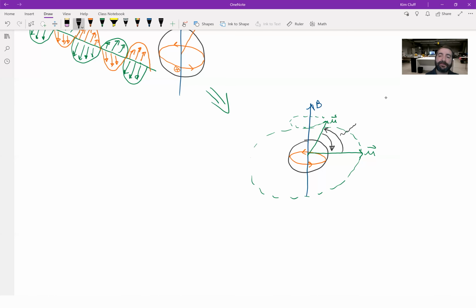And as it does that, it'll give off a radio wave, an RF frequency. So when it tips it down, this is when it's resonating. Okay, that's where it resonates. And this is when you turn off the RF pulse, it releases that energy.